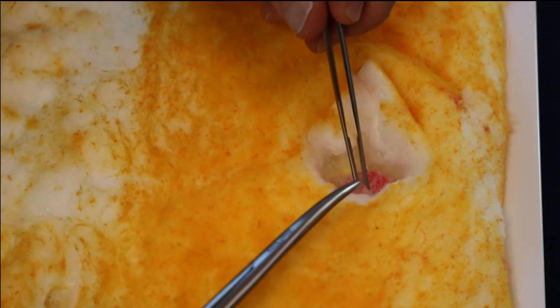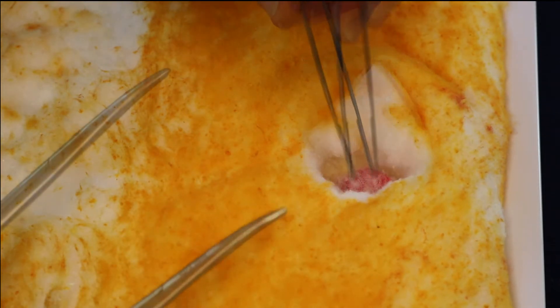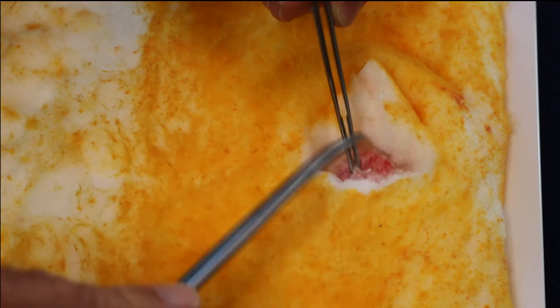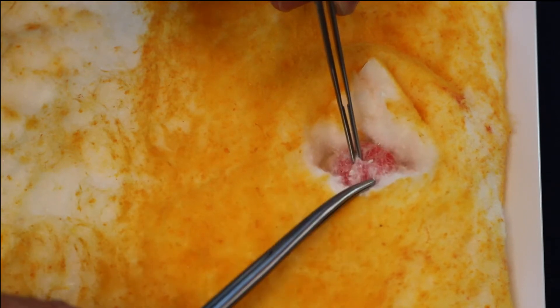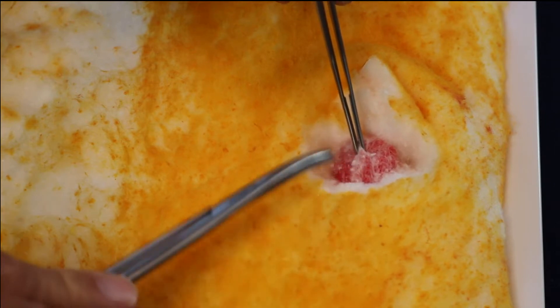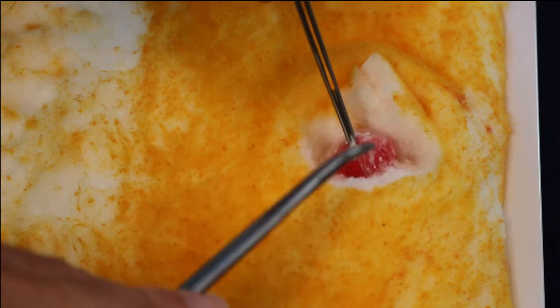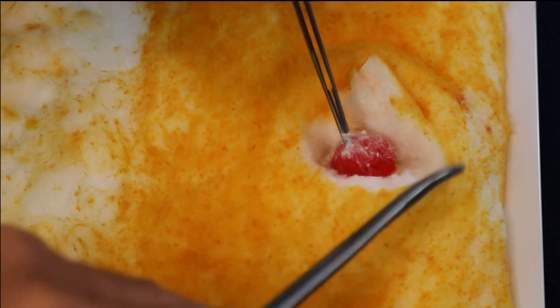This will require a combination of cutting and spreading. Going around the other side will require that you grasp the mass with your forceps and retract up and away from the surrounding tissues. Again, using your scissors with cutting or tissue separation motions will develop a plane between the mass and the surrounding material.